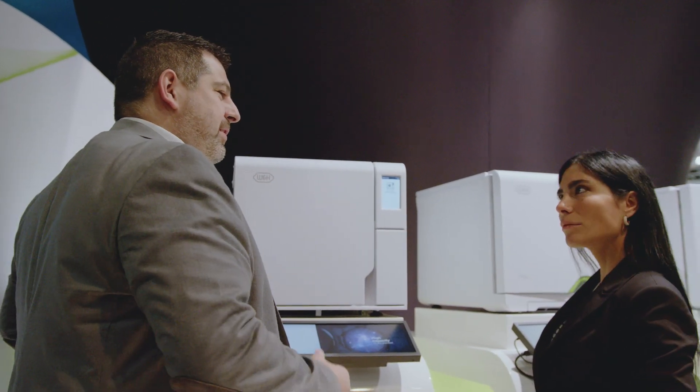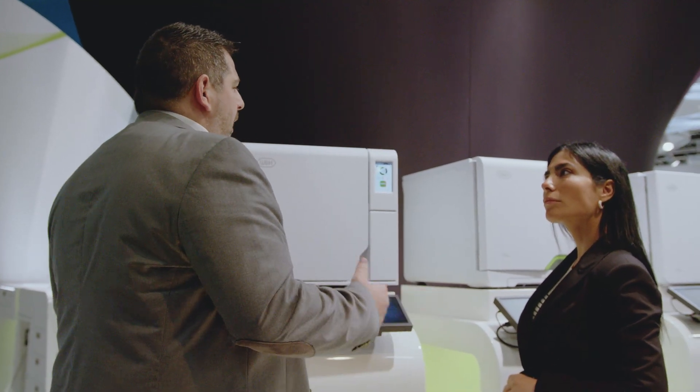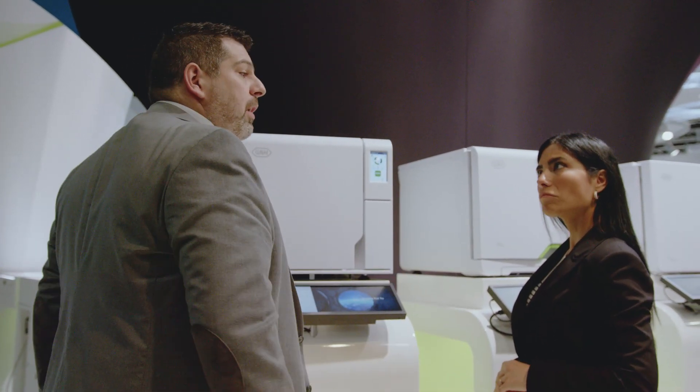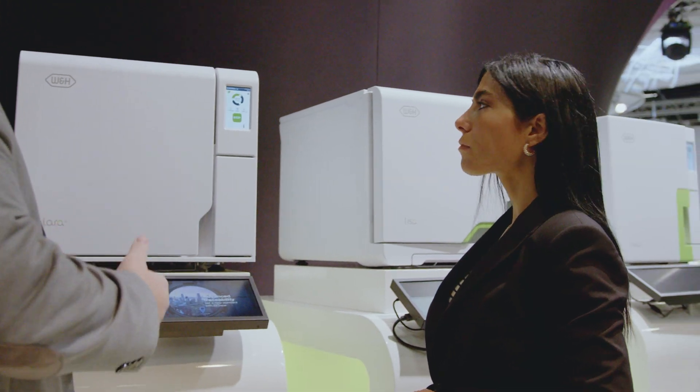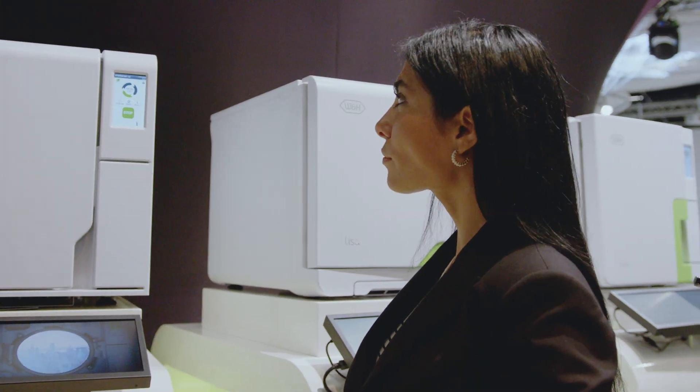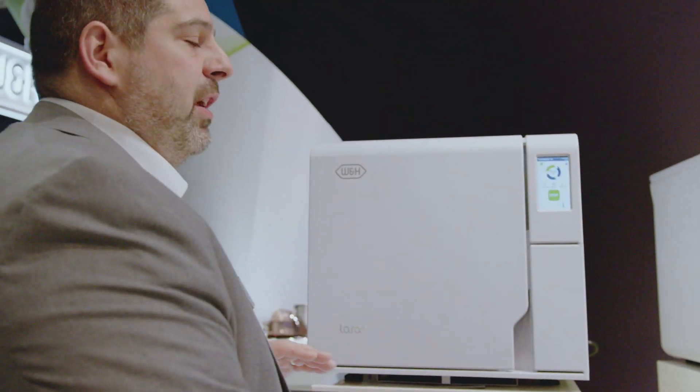Now the device is closing and starting the cycle. It takes only about 40 minutes — really fast. The consumption of water is really good. We really optimized the consumption of power, water, and also the time of the cycle. After that, you can open the door and everything is super dry.